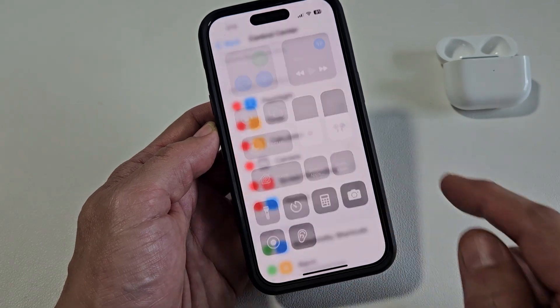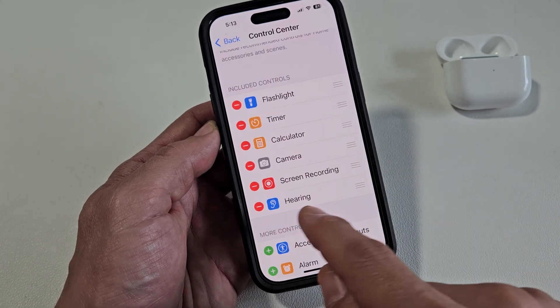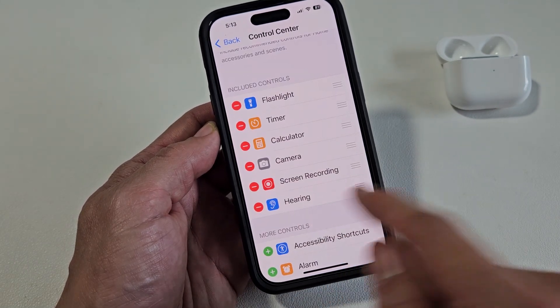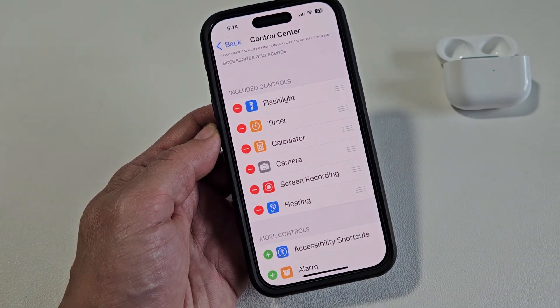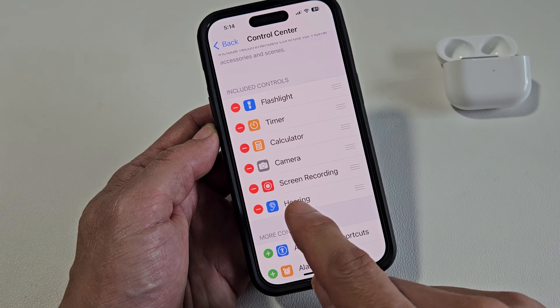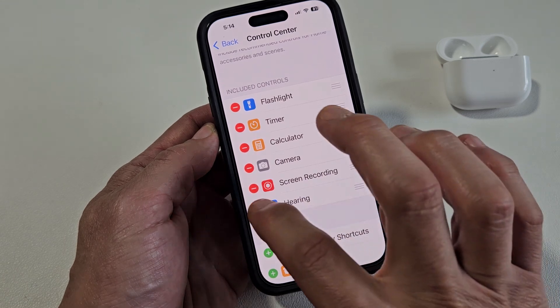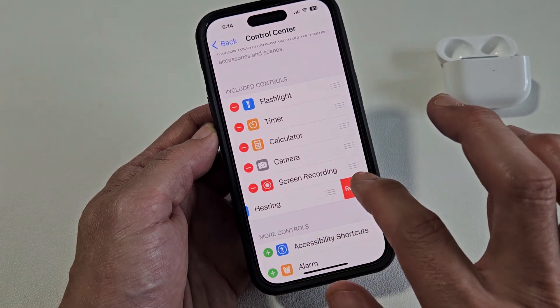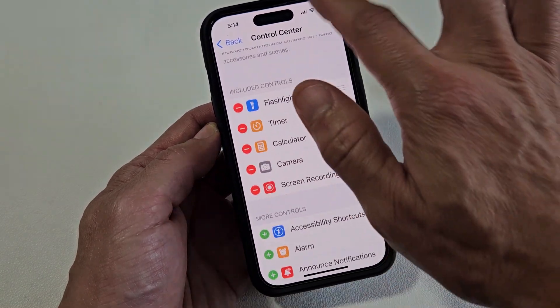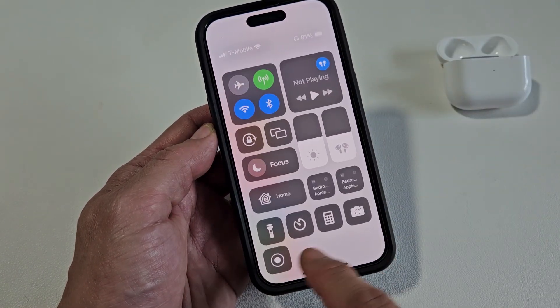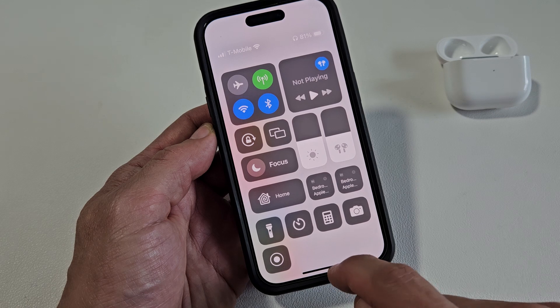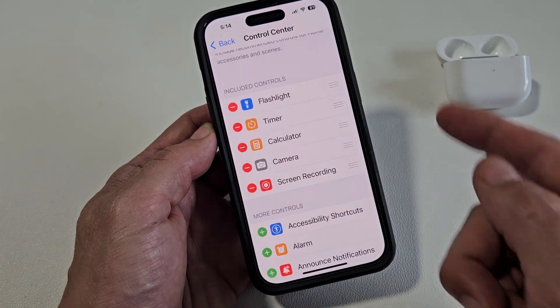On the bottom row here, I have Live Listen under Hearing. So let me just delete this — remove this — and now it's gone from here. Now let's add it back.